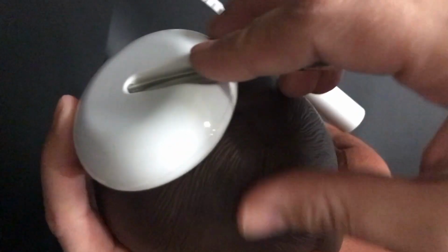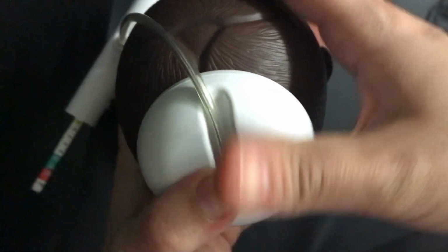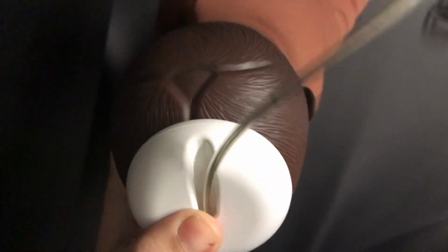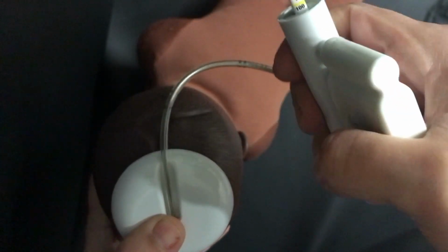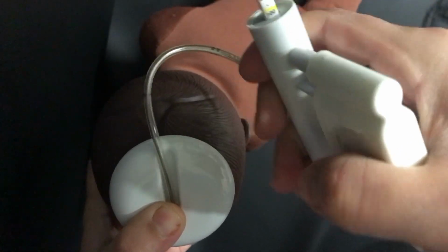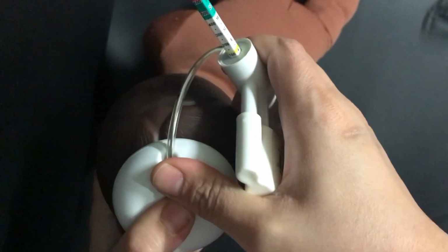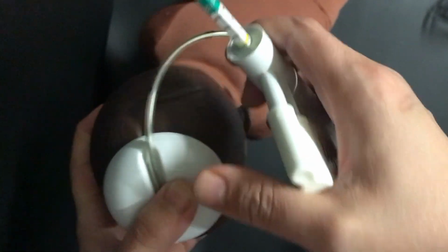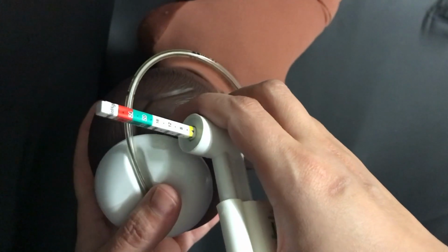Like that, and try to keep the groove in line with the sagittal suture. So this will be the correct application. Usually when we pump to create the suction, in real life the cup will really stick to the head, but because this is just a plastic doll, it's very difficult for it to stick, as there are no secretions or tissue to be sucked into the cup. Okay.